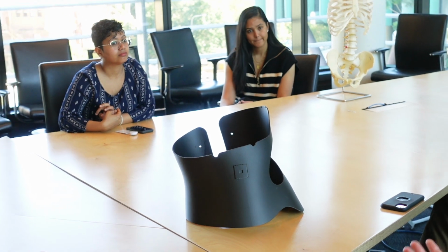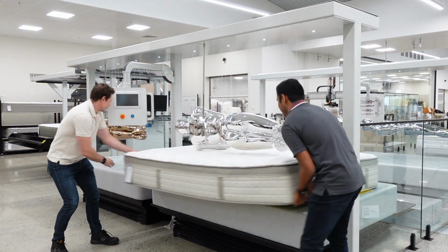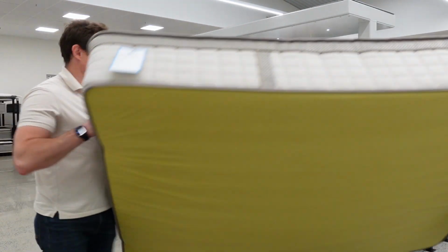So to tackle this surgical positioning challenge for young patients, we combined our current and new discoveries in paediatric spinal deformity and sleep biomechanics to develop an innovative digital workflow to create patient-specific theatre mattresses for patients having spinal surgery. So the workflow encompasses 3D imaging and simulation, biomechanical and movement measurements of patients, and a novel customised digital design workflow to create a mattress that can safely support each patient. Then our industry partners at Sealy of Australia apply a bespoke manufacturing workflow to produce the custom foam mattress for the patient. A patient-specific theatre mattress means that during lengthy surgery, weight can be taken off prominent anatomical features and children can safely undergo much-needed spinal deformity correction.